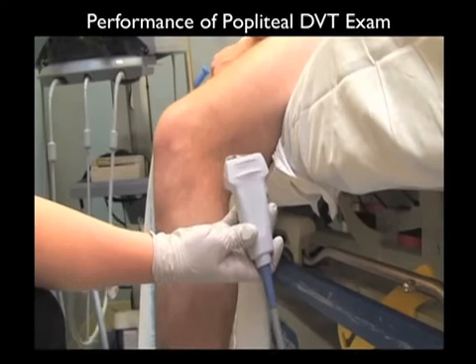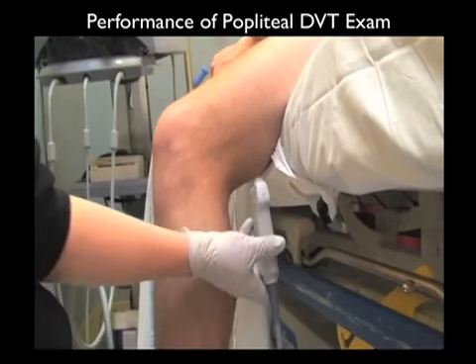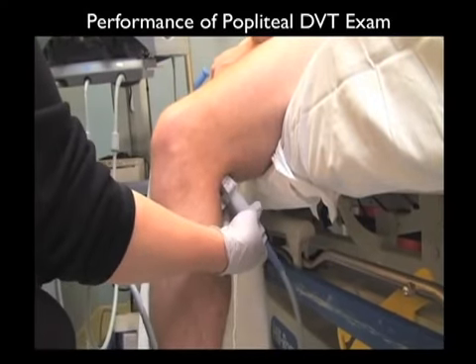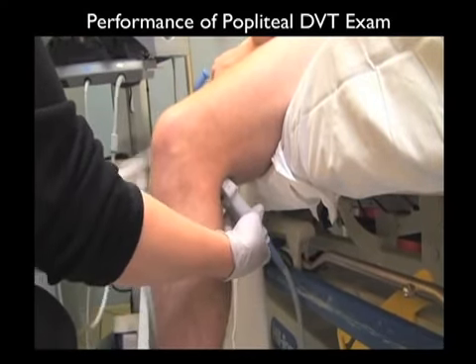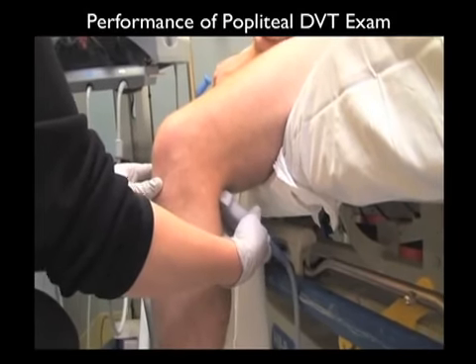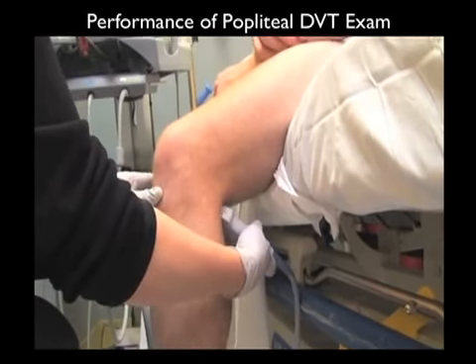Here's how to perform the focused DVT ultrasound exam looking into the popliteal fossa. It's best to have the patient sitting up to further distend the popliteal vein, and I like to have the patient sitting up with the leg dangling over the bed. I can then pull up a chair and move anterior to the patient.